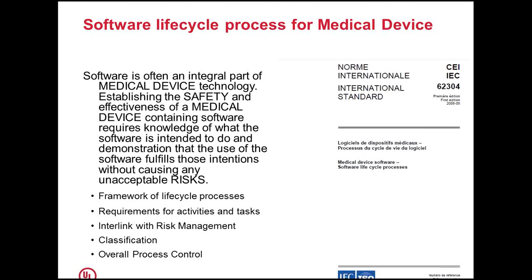What this standard talks about is it gives a framework for the lifecycle process. It gives the requirements for all the activities and tasks to be performed while developing the software, and the interlinks with risk management. And it has requirements for classification, and requirements for overall control of the process. We are going to discuss all these things in the coming slides.